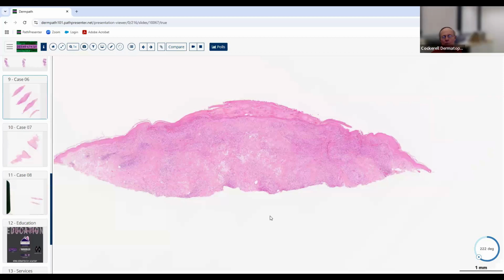Yeah, good. That's the most common location for all biopsies, the trunk or proximal extremity. We would certainly rather biopsy an inflammatory process, or even a neoplastic one for that matter, if it's widespread, on the trunk or the proximal extremities if we can, as opposed to the scalp or the nose or the mucous membrane. So yeah, pretty nondescript skin. It looked like perivascular inflammation, at least superficially, probably deep as well.